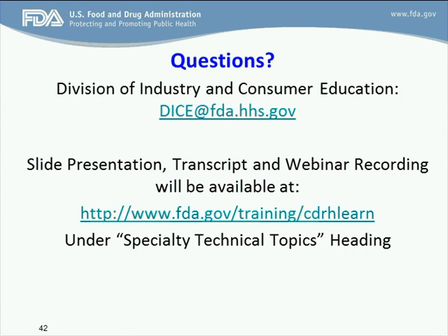Okay, thank you. And one additional comment on that. Different cleaning chemistries are going to be more effective or less effective depending upon what they're supposed to be cleaning. As you'll see in the validation sections, there's emphasis on picking clinically relevant soils to simulate contamination in use. And the cleaning chemistries that should be chosen should actually address what those contaminants are. So if something is going to be very high in protein or very high in carbohydrate, and you're choosing a type of enzymatic cleaner, you want to choose the types that are lipases or proteases or whatever it is that you're looking for.